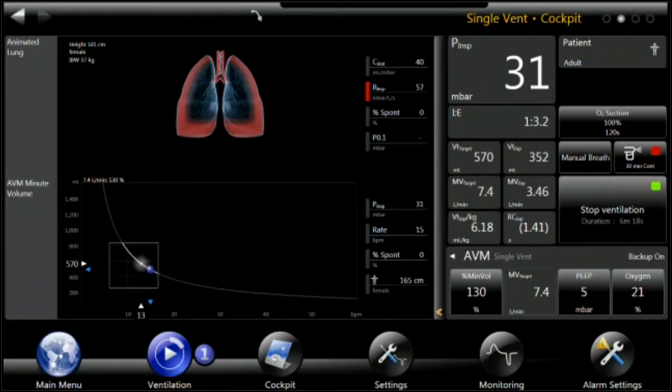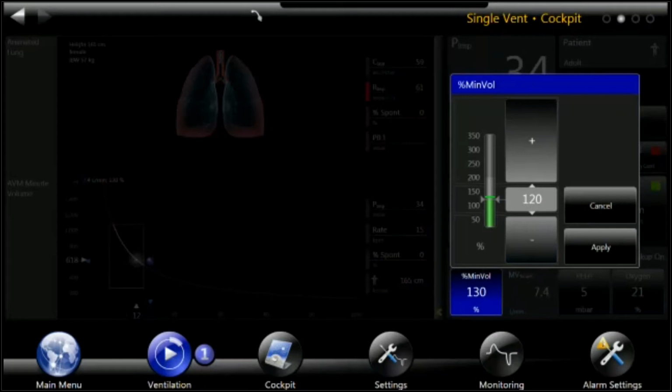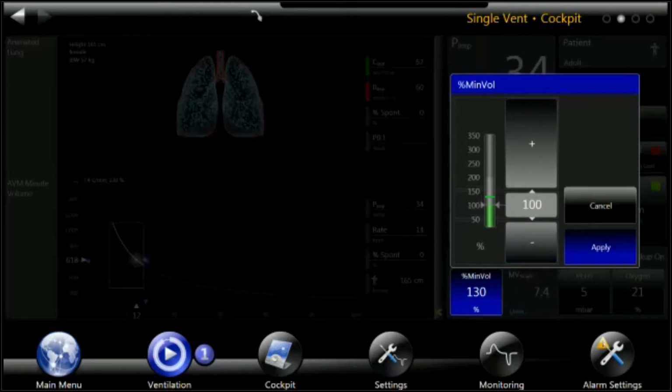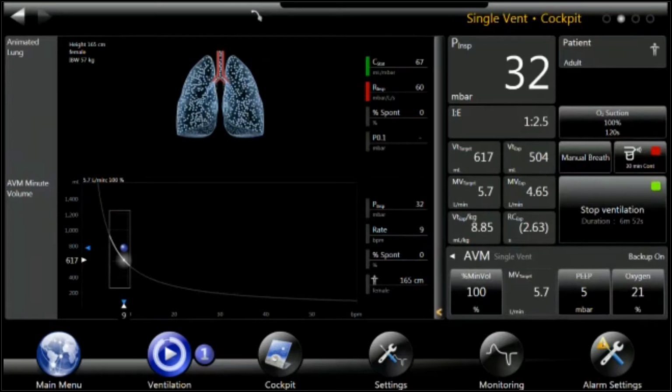and now you see for this patient, the respiratory rate is very low, because now I have 2.6 seconds of expiratory time constant, which means that this patient needs around 7 seconds to exhale fully. It's still adapting, but now it has run out of possibilities. So I adapt also the resistance. So now you see the window gets bigger, and the possibilities for AVM to adjust are getting higher and higher again. But you see that it's really depending on the expiratory time constant.